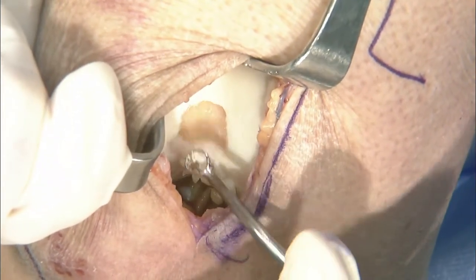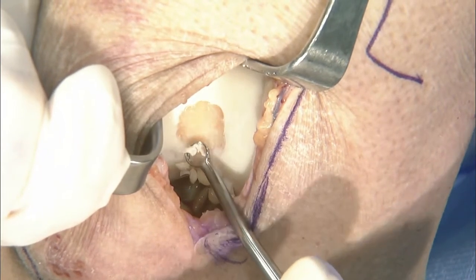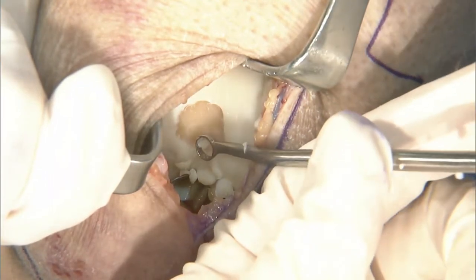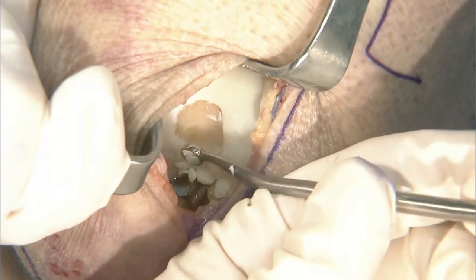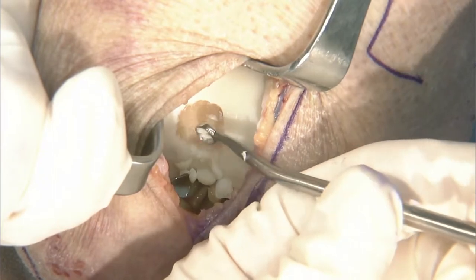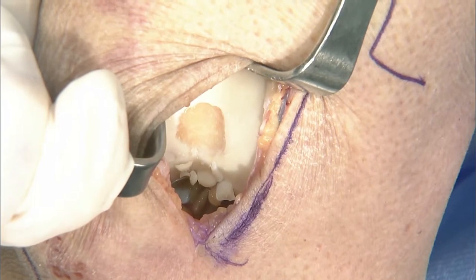Yeah, I think the other thing that we can talk a little bit about since we're doing freehand prep here is what to do when you have a non-contained lesion, meaning something that's typically medial femoral condyle spilling off into the intercondylar notch, or in the patella as it's going off into the side. At least in my experience with MACI, I've tested out some fairly non-contained defects, and it's actually very stable with that glue, just in terms of how it's put in and the adherence to the subchondral bone. I actually haven't had to use any sutures. And I probably have done some that have been only 65, 70% contained, especially in the patellofemoral compartment.